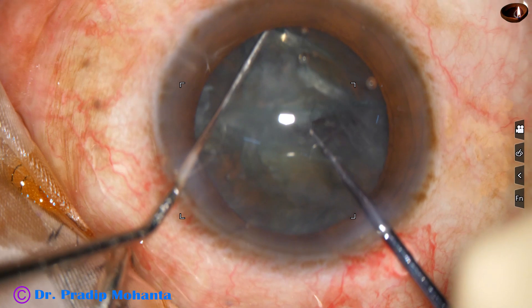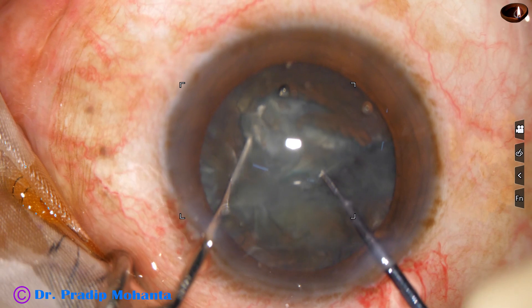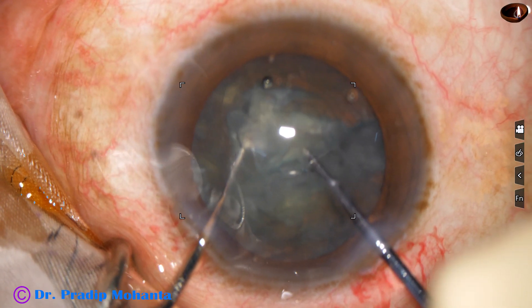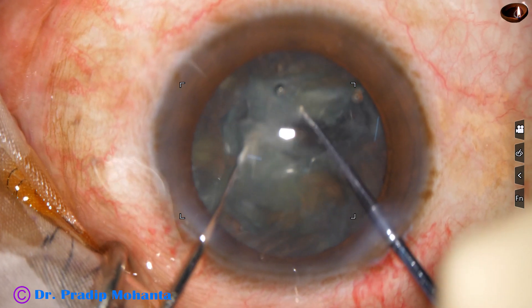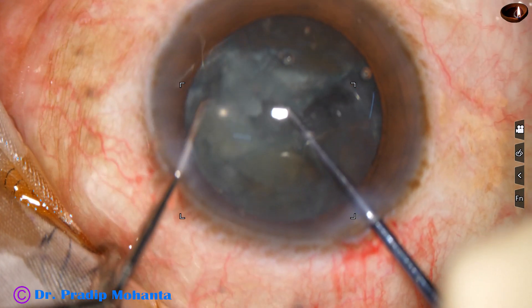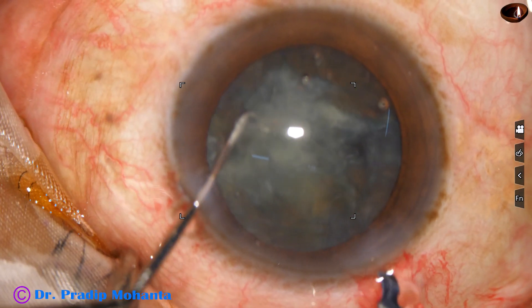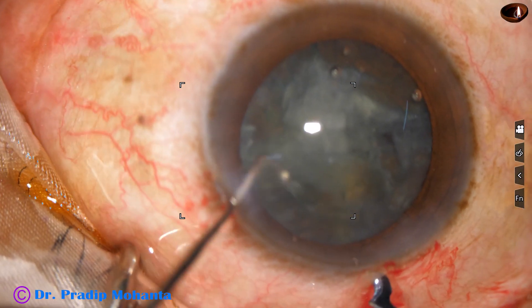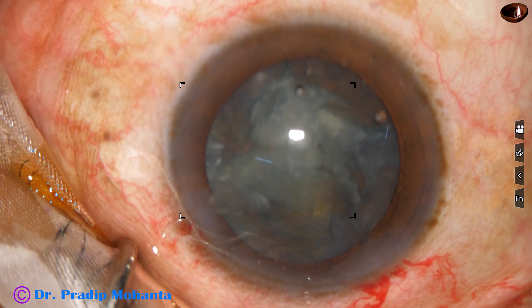The nucleus is rotated. The pre-chopper remains in the groove and now the sustainer comes and the pre-chopper goes towards each other, and one hemi-nucleus is divided into two fragments. The two instruments are brought out and now let us go to real speed again.